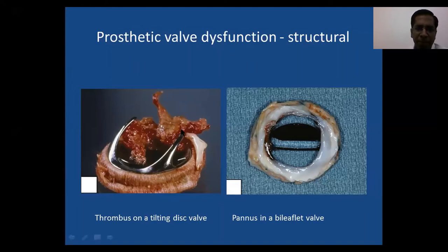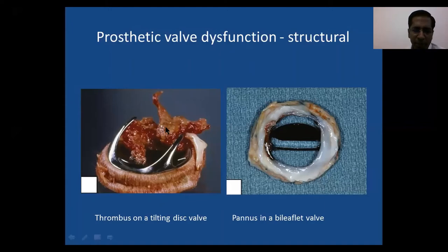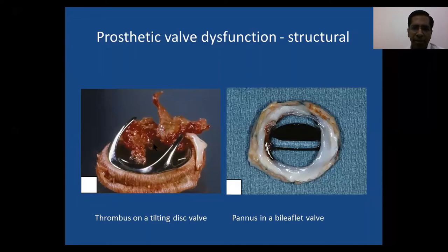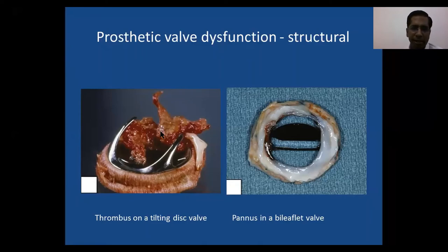If we don't see obvious thrombus, that doesn't mean it's absent — the history and other findings matter. An important sign: intra-prosthetic aortic regurgitation can indicate prosthetic valve obstruction. When thrombus obstructs the opening/closing mechanism, the valve cannot fully close, resulting in regurgitation. So unlike native valves, intra-prosthetic AR in this context can be a sign of obstruction rather than a separate process.